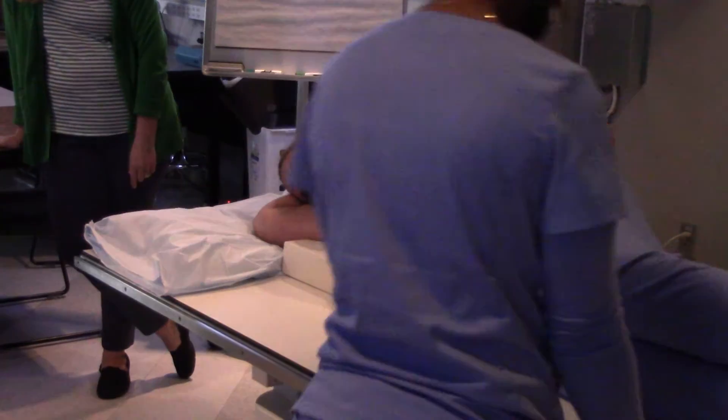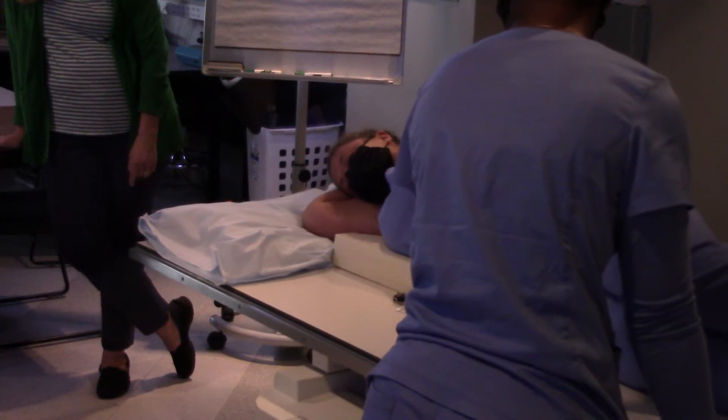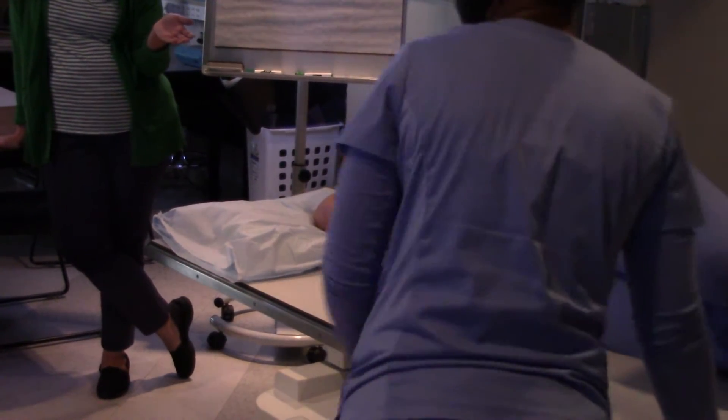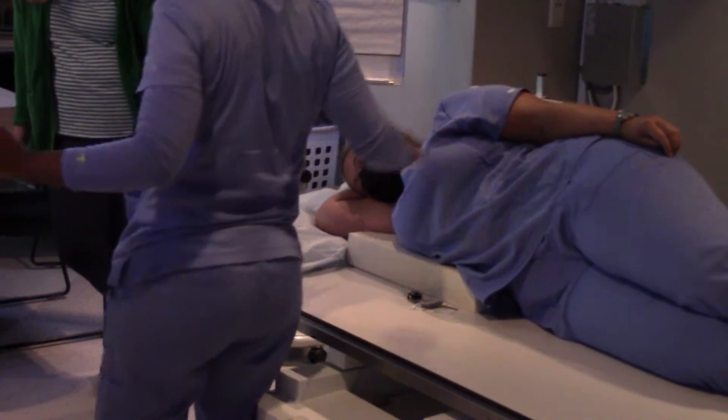What you can do is move the table back as far as it will go. We're not primarily looking at a heart here, but it does reduce magnification for fluid levels so we can get everything on there. You should be able to get a good 60 inches of SID.